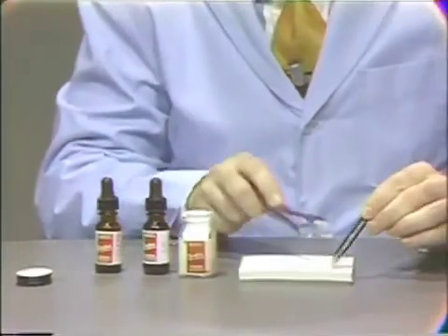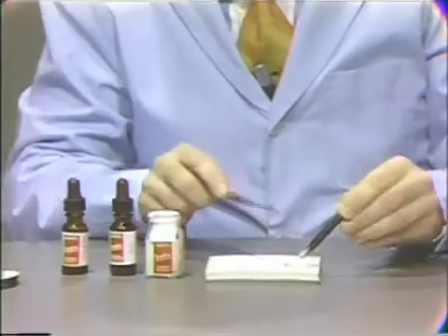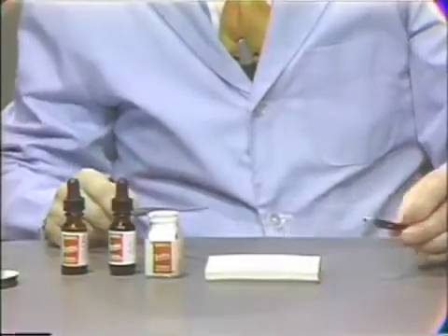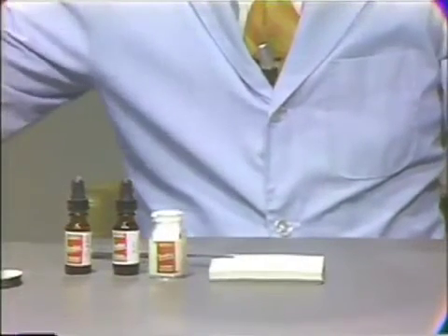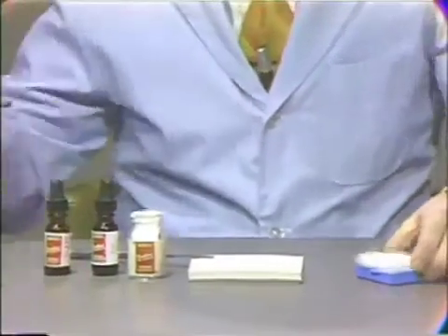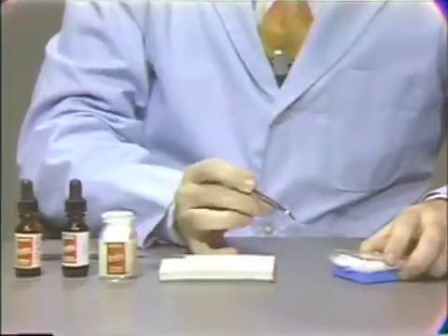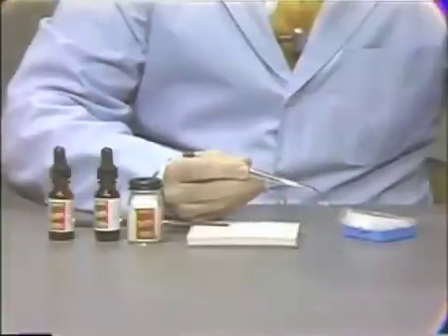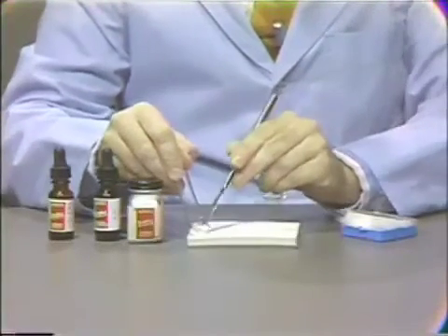We'll set off to the side one small cup of powder for use after we've reached proper consistency. In areas where we would like to gain additional strength, we will add a few cotton fibers. Very few fibers are really needed to gain that added strength. We'll set these fibers aside and come to them after we've reached consistency.